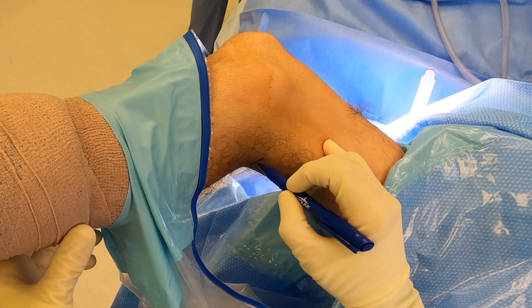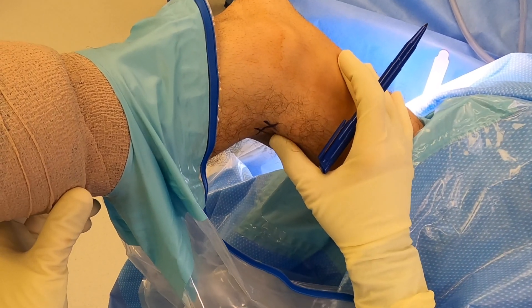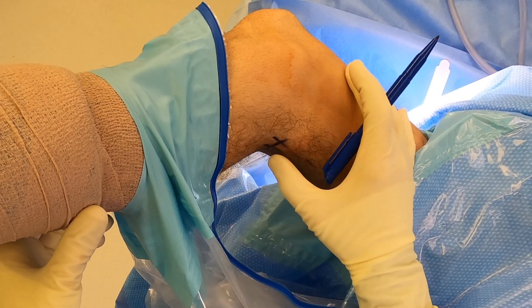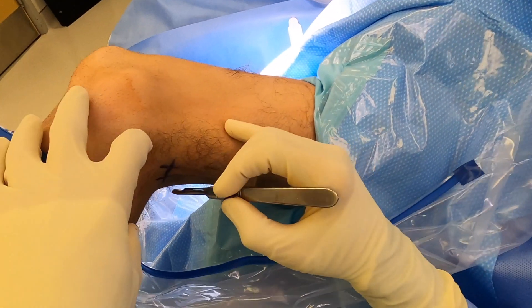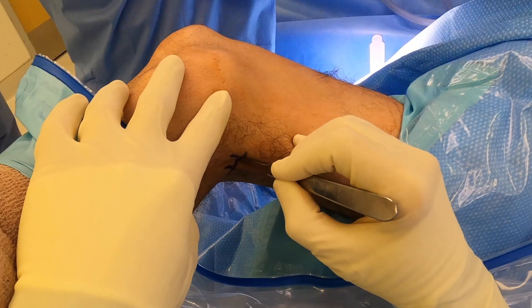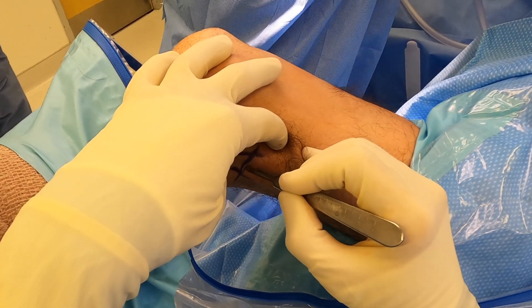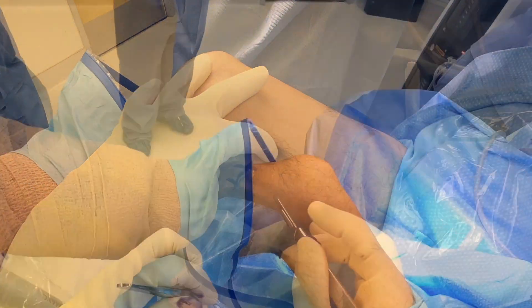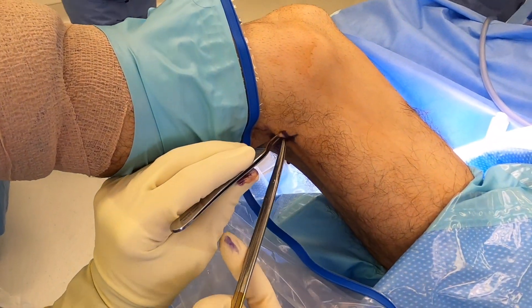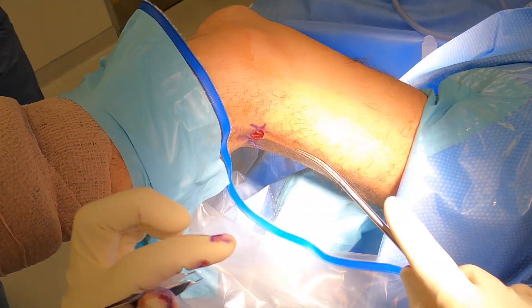Here we are looking at a right leg. I am first marking out our landmarks with my thumb. You can see I can feel the semitendinosus, which is the thickest tendon there and will be the center of the incision. I will take the knife through the skin superficially, being careful not to go too deep — especially in the thinner person where the tendon is directly underneath.